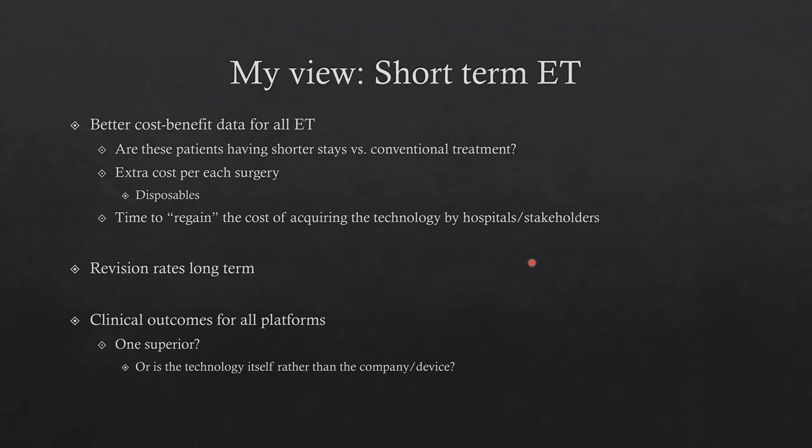you really have to dedicate yourself to this and say, all right, I don't care, it's going to take much longer, but I want to do this for a year so everybody gets comfortable, so we can all be on board and get the timing of these cases down. But I've never found the robotics cases to be comparable to those navigation cases. I can't believe that's the case. There's so much more setup, so many more trays, so much more that goes into those cases than a standard navigation case, you know?